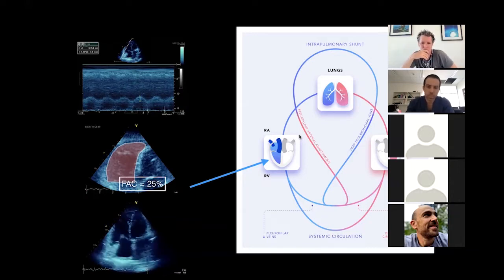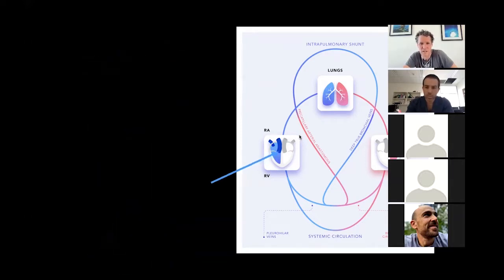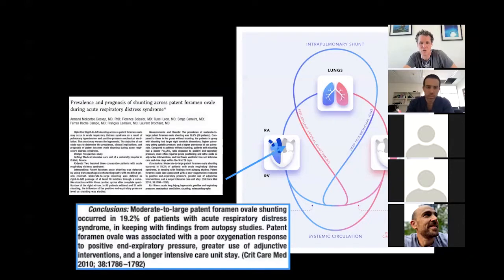So, yeah. We talked all about RV systolic function. I don't even need to go through that again. Okay, shunts. How common are shunts, Vishal, in the critically ill? So it's not uncommon. Patent foramen ovale is 1 in 4, so around 1 in 4 to 1 in 5 patients have a patent foramen ovale.